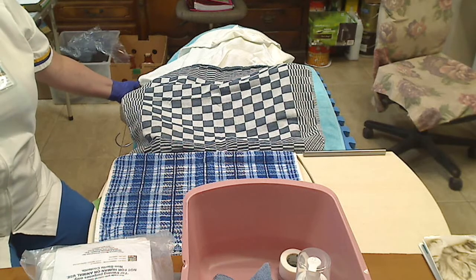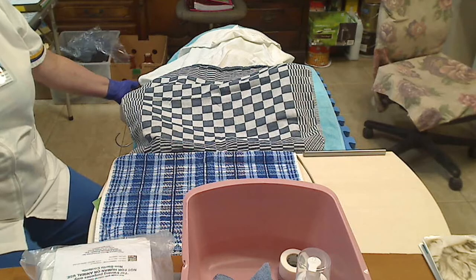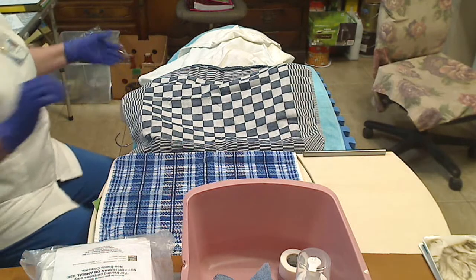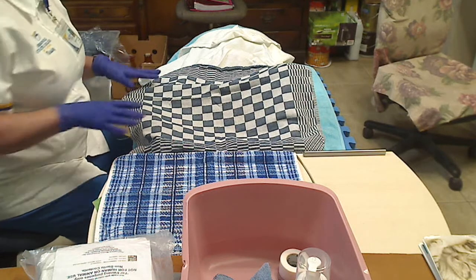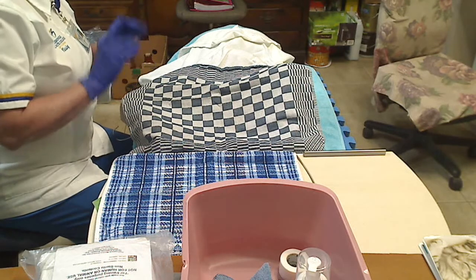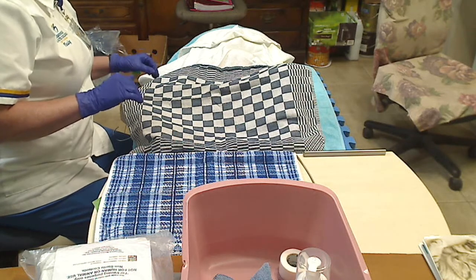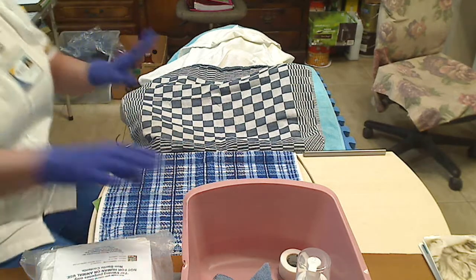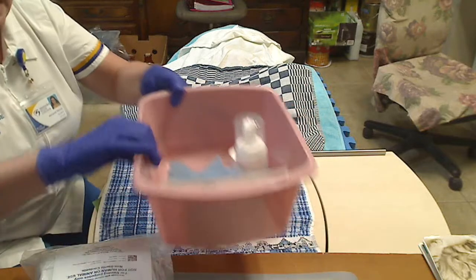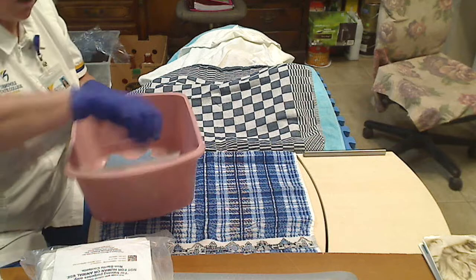And every time I do something, I'm going to explain to her what I am doing so that there's no confusion. Okay, so Miss Anna, what I'm going to do now is I'm going to go ahead and remove some of your blankets, and then I'm going to go ahead and clean your area for you before we get started. Is that all right? Yes. So I'm going to get my bucket. I'm going to go over to the sink and get mildly warm water so that it's comfortable for her.